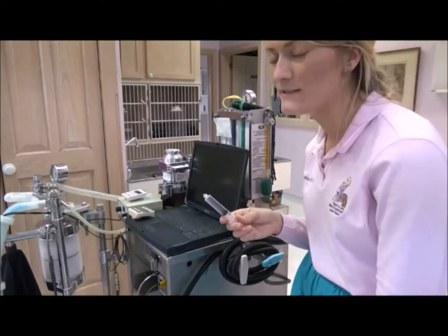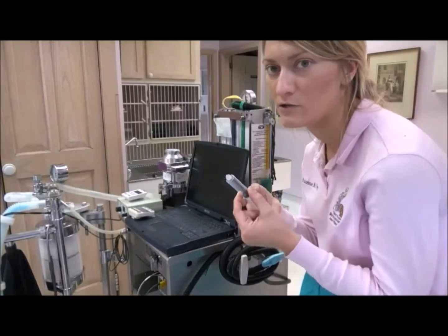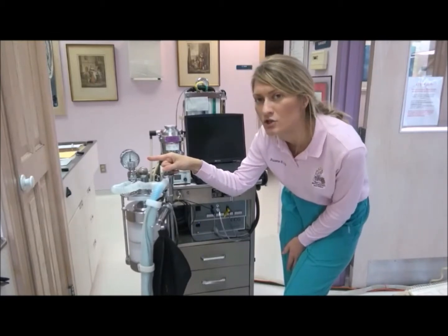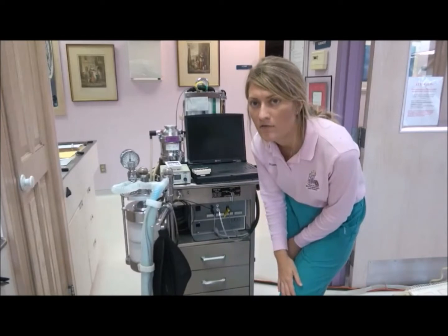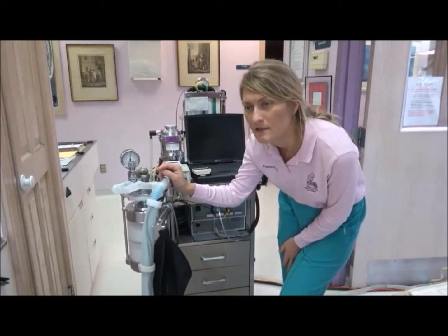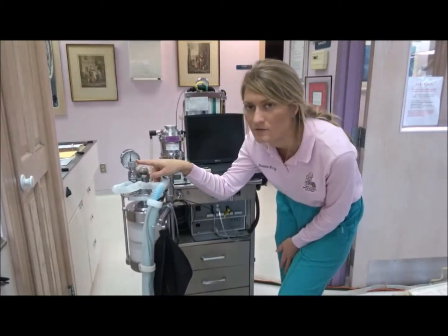It's simply a 12cc syringe, and we use this to inflate the pressure cuff on endotracheal tubes. This is the pressure manometer. So this indicates the amount of pressure in the anesthetic circuit, and thus tells you the amount of pressure in the animal's airway and lungs.